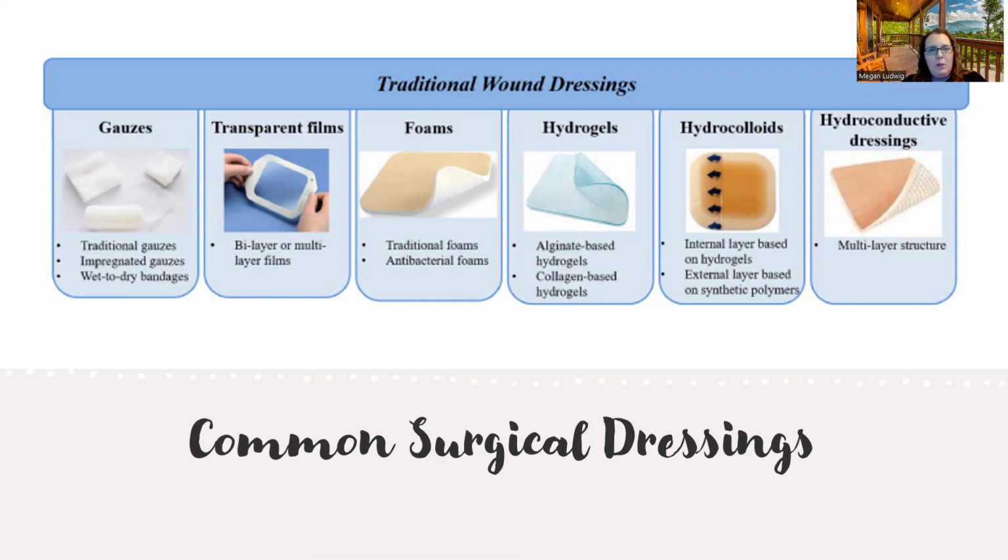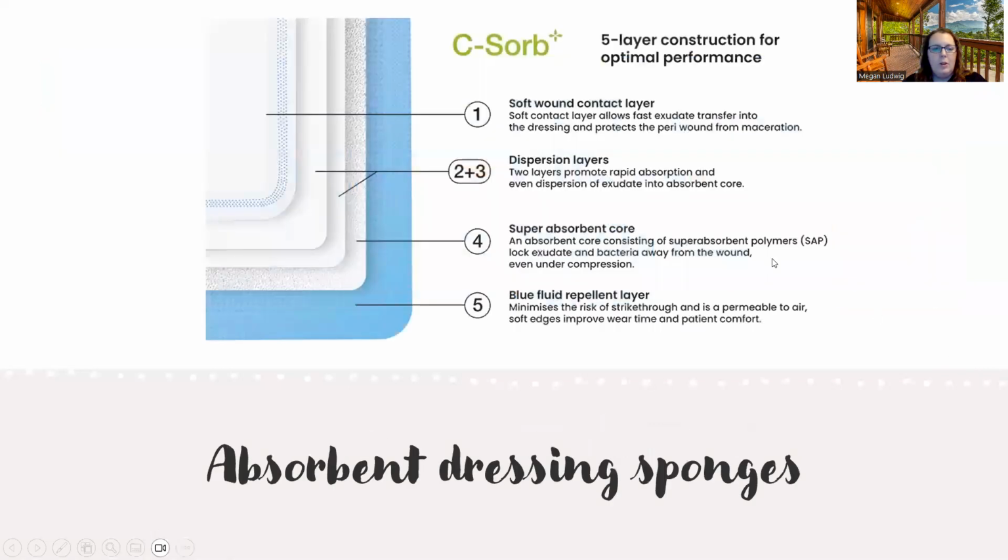Like if you've ever had an IV, right? They're probably just going to put some sticky film over it to keep it in place. So it's not good for anything oozy, like a lot of blood coming out. There's no absorption. Okay. You've got your foams, which are nice. They're kind of padded. They might have an antibacterial right in it. These hydrogels could be good for burns, same with hydrocolloids. And then some are multi-layer in that it might have these traditional gauzes with something sticky right on top to go right on that incision. So that's what this is here.